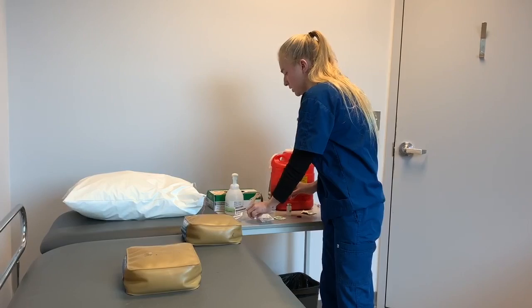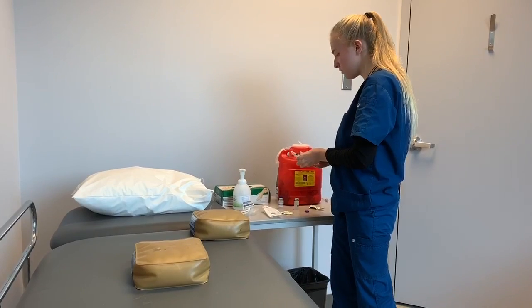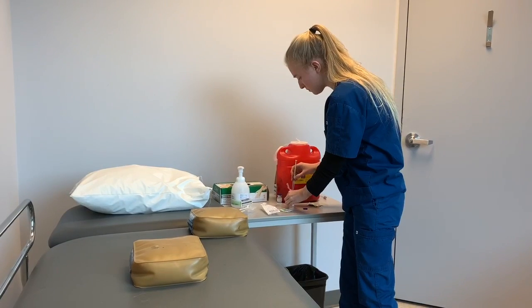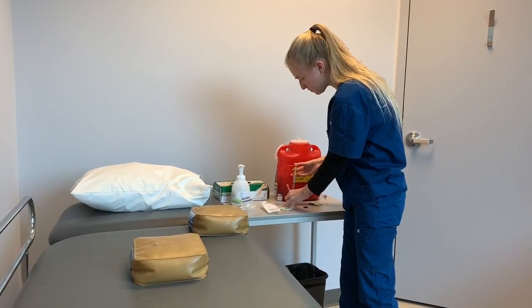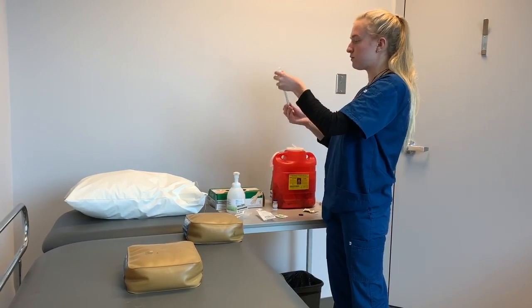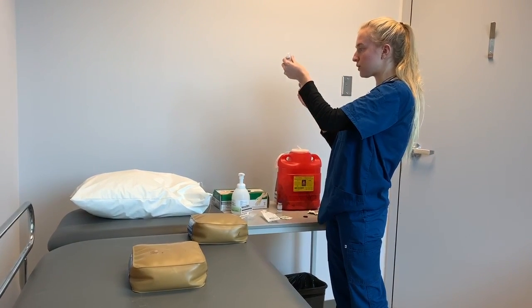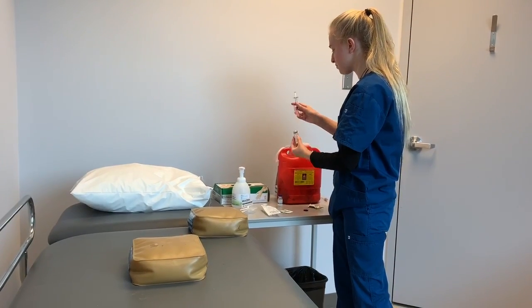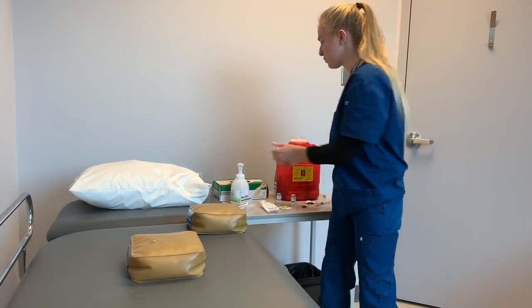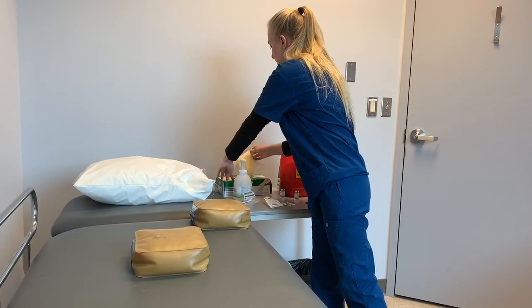Okay. Now I'm going to take the cap off of my syringe. First I'm going to inject air into the vial to make sure there's no air bubbles. Okay, now I'm going to draw up 1 milliliter of heparin. I'm going to put the cap back on and set it down. Perform hand hygiene again. And I'm going to put on the gloves.